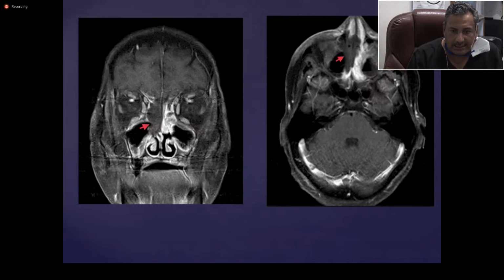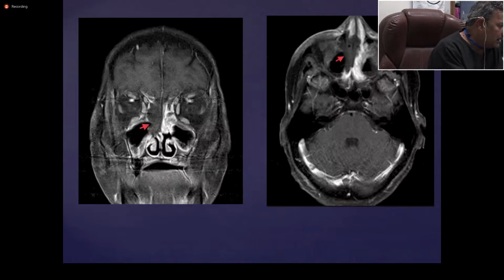Remove that gangrene. It's a sort of gangrene, a dead area, to make the medical treatment effective, to make the enhancing areas penetrable by the amphotericin. See a few examples. See this patient. See these turbinates on this side, the normal side. On contrast, they're enhancing. On the other side, see the turbinates. It's all necrosis. On the opposite side, it's all necrosis.